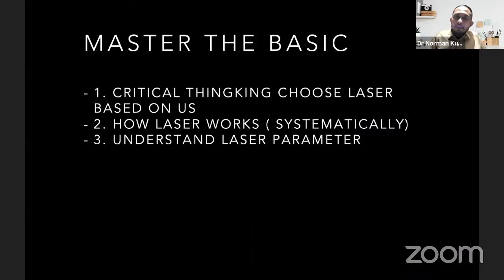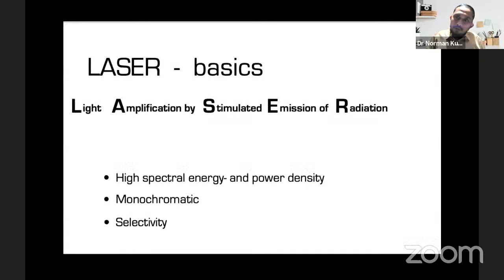So why laser? Because in my opinion, laser has many benefits and many biophysical interaction radiation that cannot be touched by non-instrumental or conventional dental instruments. Just like I mentioned before, I always do chapter 1, and chapter 2 will be brought first with Dr. Ellie, after I finish this basic theory.